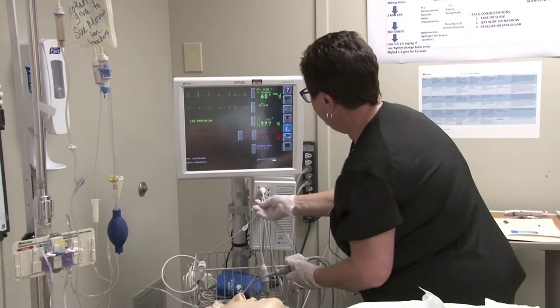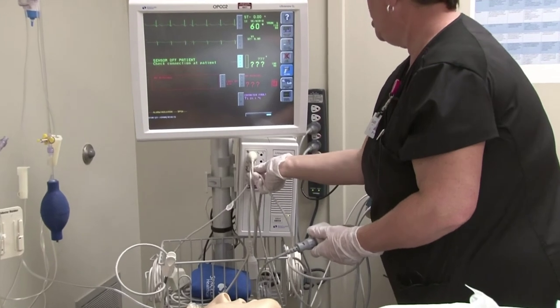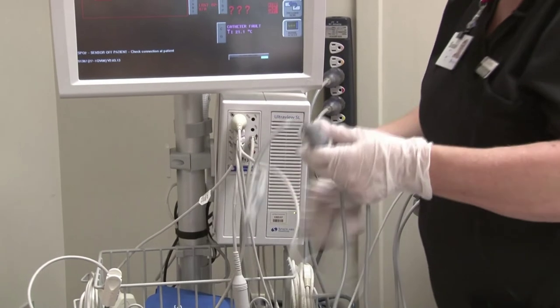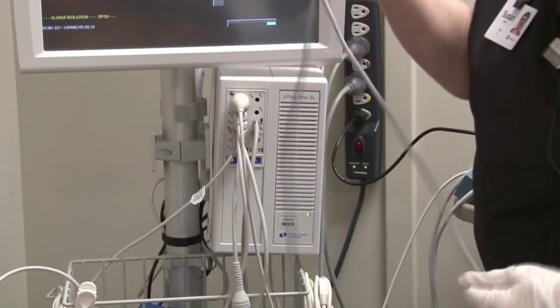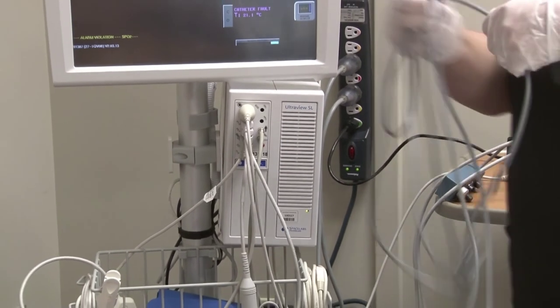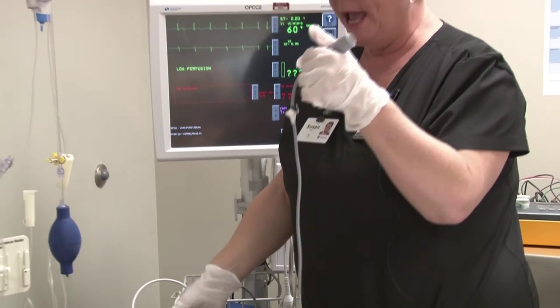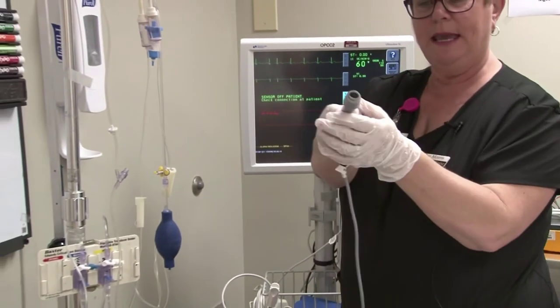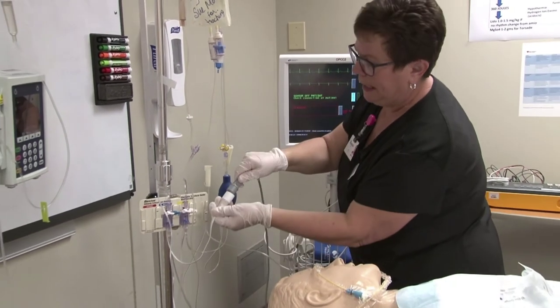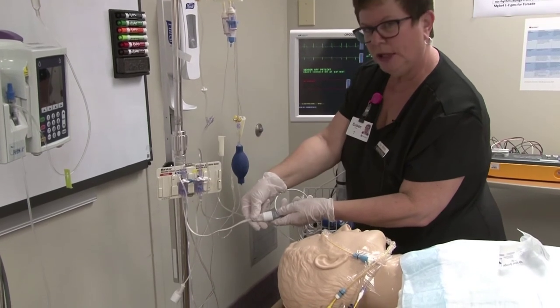The other end of the cable friction-fits into the white tail of your flush line.